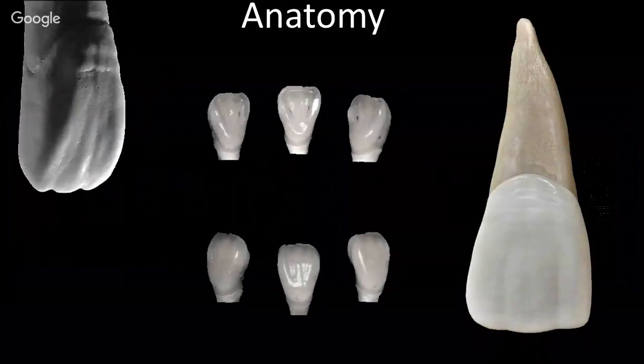Just look at the beauty, look at the natural, so we can appreciate the lobes, the mamelons, the horizontal lines, as well as the transitional line angle, the vertical grooves, the incisal margin, or the lingual fossa, the distal margin surface that is a little bit shorter and more rounded with respect to the opposite side, and as well, very, very important, the curve trend of the CEJ.